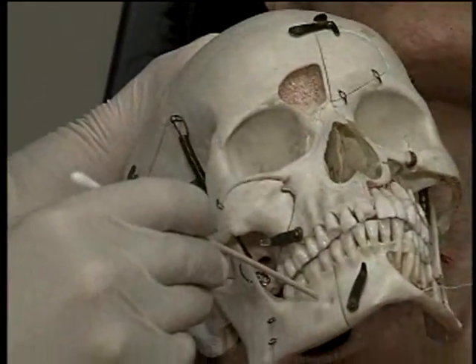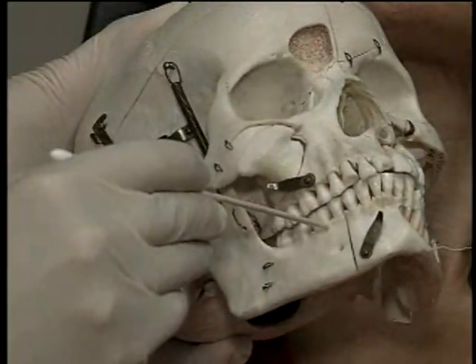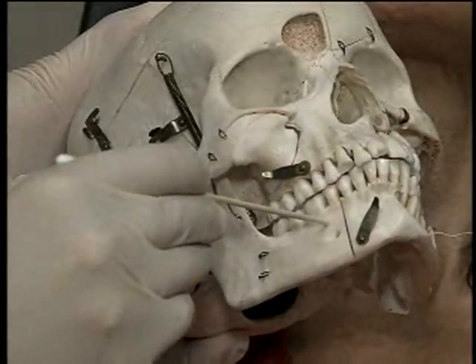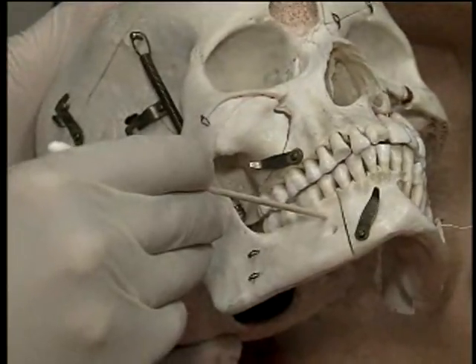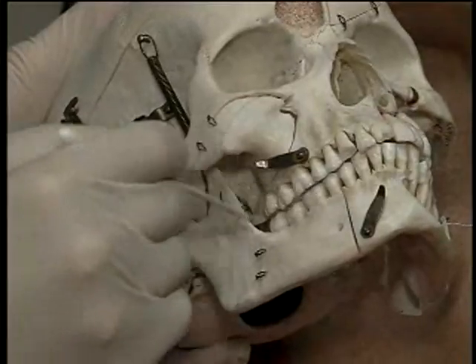When I go into the mouth, into the gingival buccal sulcus, I will look here for the second premolar. Follow the second premolar down and inject a little bit right there, just above the mental foramen. And that's where I'm looking to do a technique to anesthetize the whole lower lip.